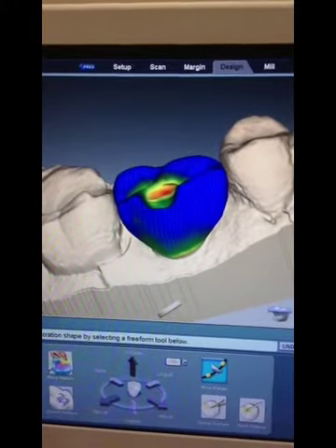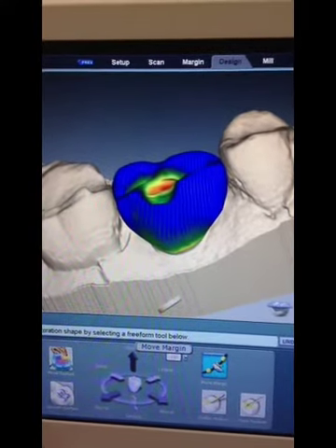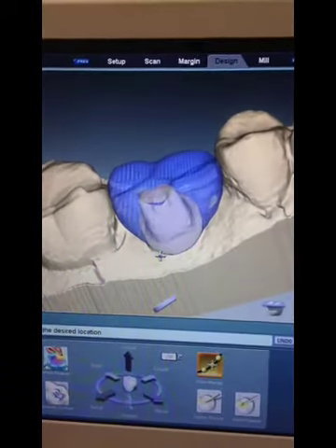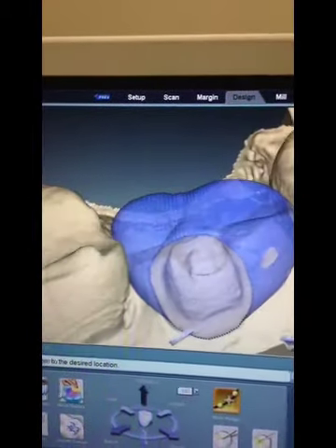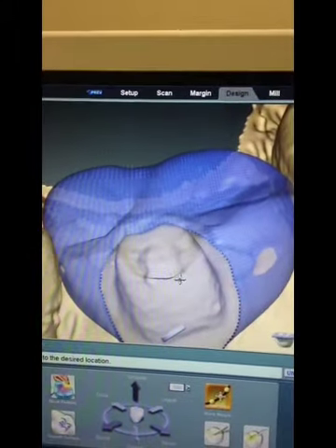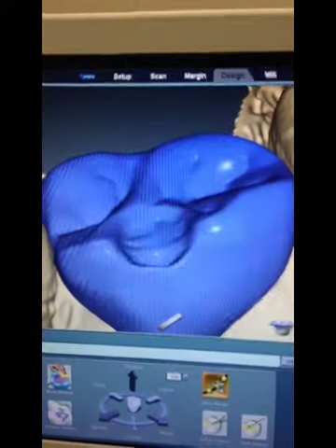We're going to have the crown cemented onto the abutment, and the abutment open so that we can screw it straight into the implant. So anyway, we make our crown, and then we just take away that little spot. We just make sure that it's right over that. Alrighty.